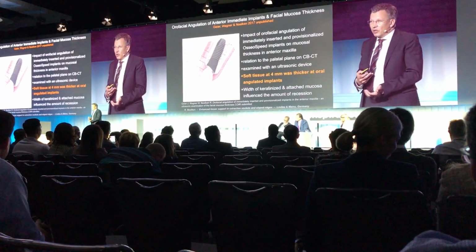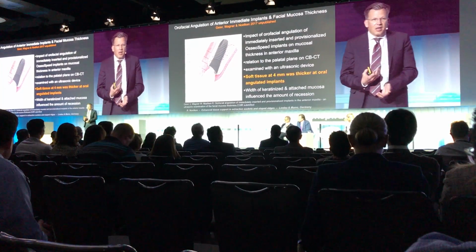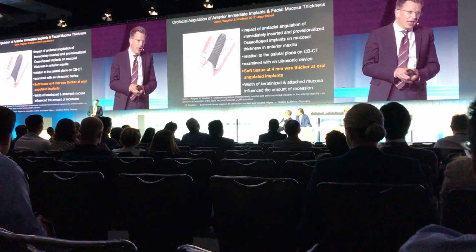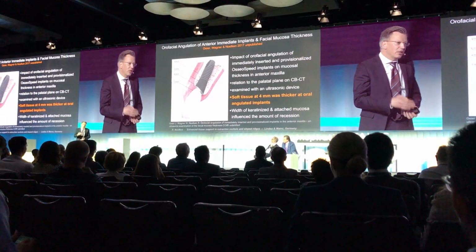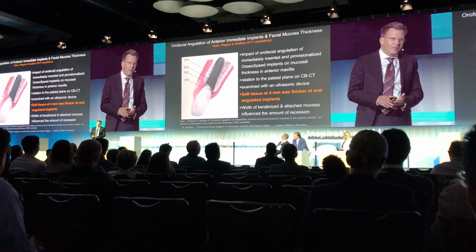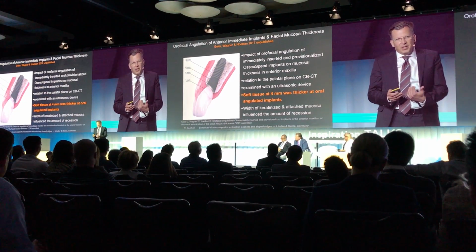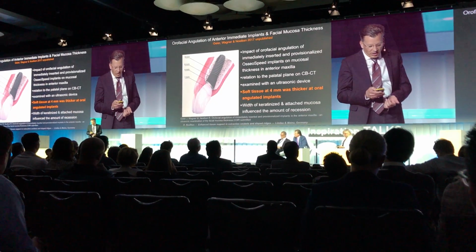As we also know from our own studies, we have a significant impact of the angulation, or facial angulation, of the implant to the palatal plane on the tissue thickness at 4 millimeters. We measured this with an ultrasonic device.